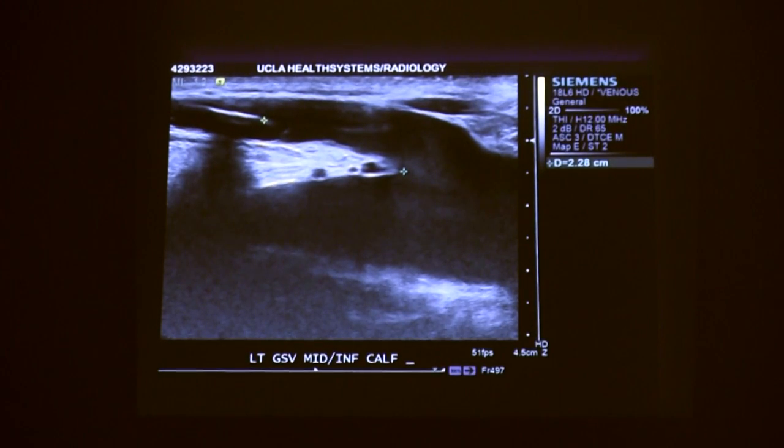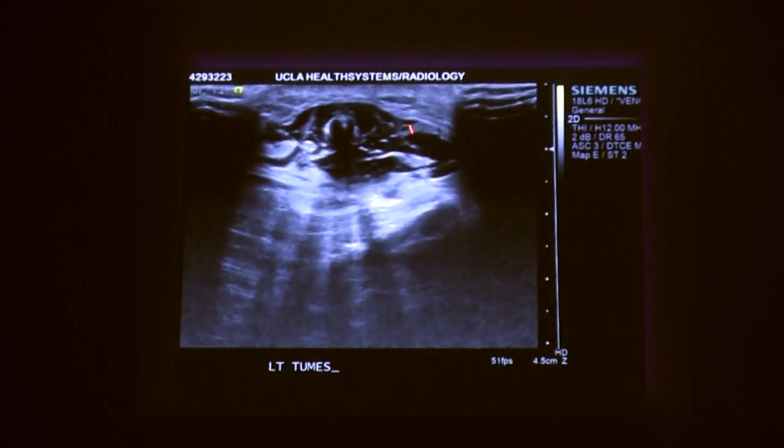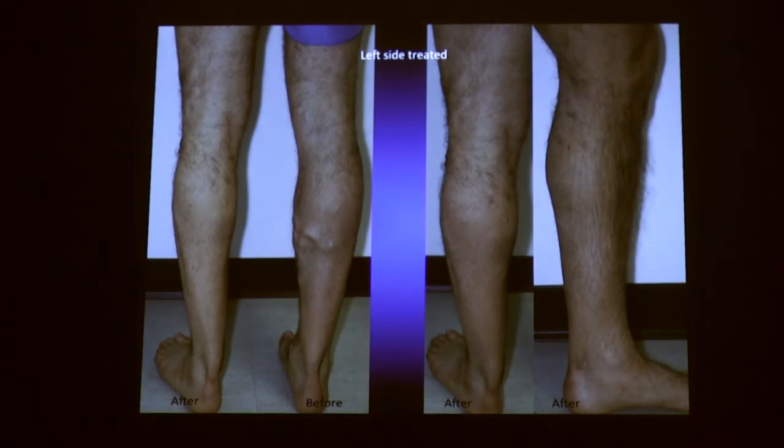So we take our piece of spaghetti, our catheter, and we advance it to where we want it, and we heat the inside of that vein. We put our tumescent, now you know there's saline that we put all around that vein. We smush it on the catheter and we heat it to close it.